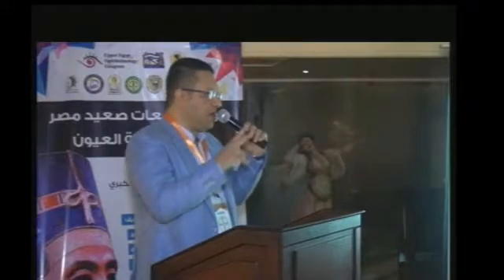طيب خلاص حصل ريجل اكستنشن وخلاص، قدامك حاجه من الاثنين، خد بالك يا اما تقلبها كونفنشنال تقلبها اكسترا كابسولر توسع الويندو وتطلعها، او انك تعملها ديليفري سوبرا كابسولر وتعمل فيكو في الانتيريور تشامبر. بس قبل ما تعمل الخطوتين دول لازم تعمل كذا راديال اكستنشنز عشان ما تعملش ستريس على 1 راديال اكستنشن فيلف لورا لغايه البوستيريور كابسول.